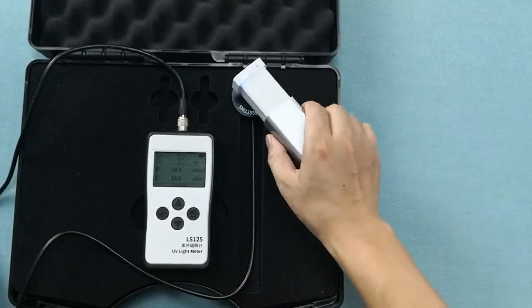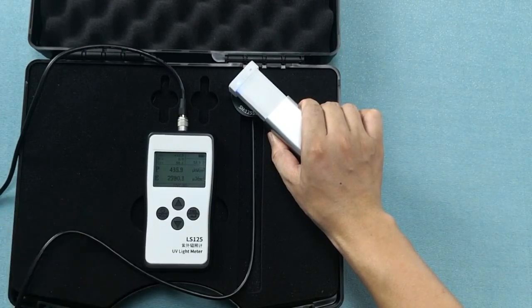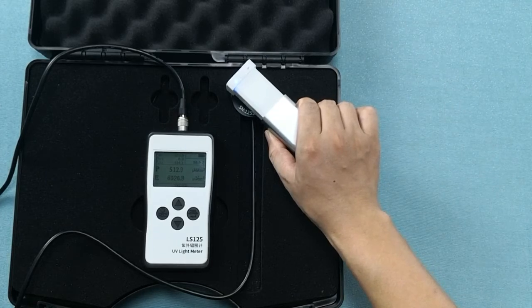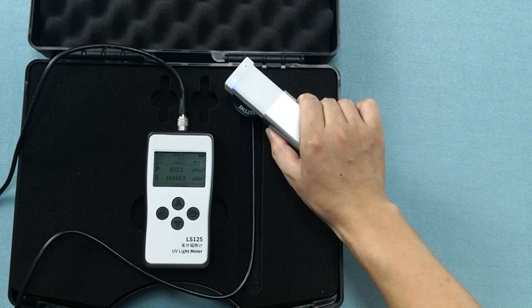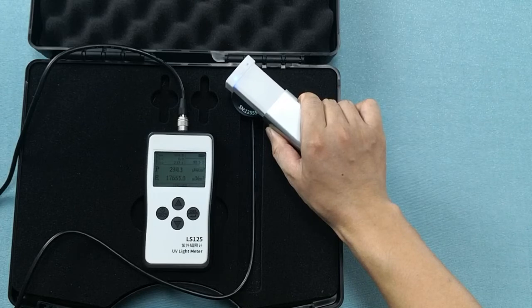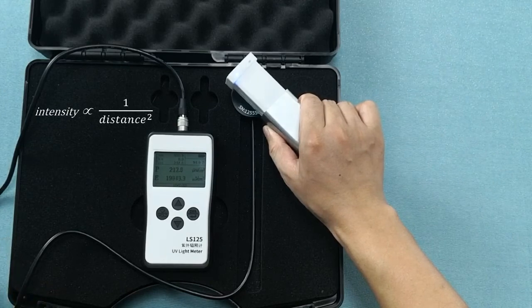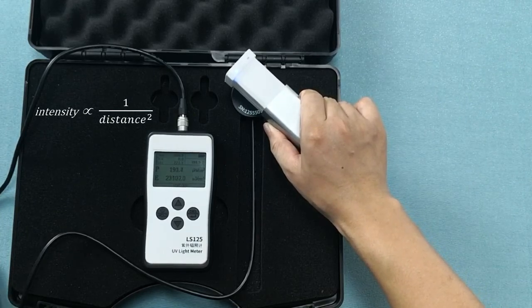Let's bring it closer to the probe — you will see we get a reading of about 400. The number keeps going up, and that's because of the physics of these low pressure mercury UVC lamps. It's going to take a few minutes for the intensity value to reach its peak and steady level. If I bring it further away from the probe, the value drops dramatically. That's because the intensity value is inversely proportional to the distance squared — meaning if I double my distance, the value drops to one-quarter of its previous value.